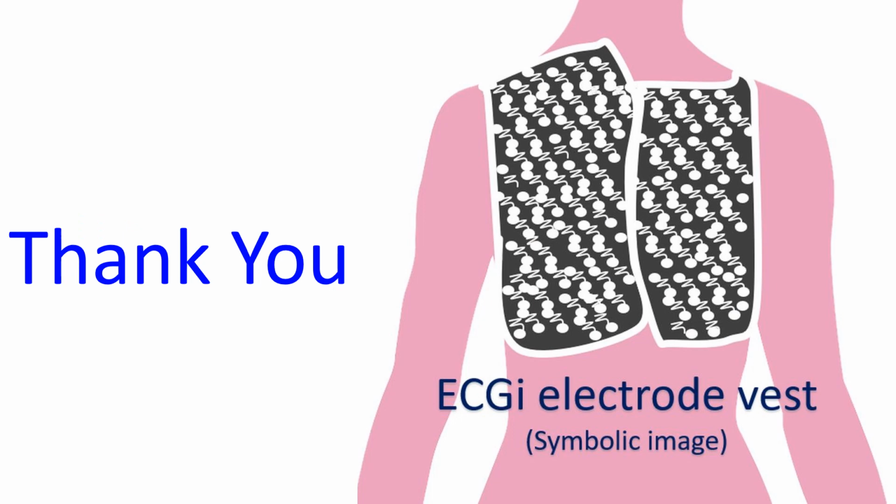This has been a very concise description of the concepts in electrocardiography in a simplified manner. The field of electrocardiography has grown a lot over the past century. Automatic algorithms for analysis have come a long way due to the enhancements in information technology.